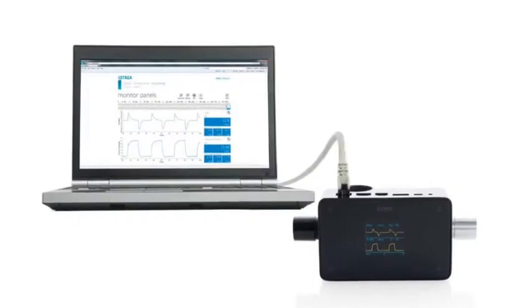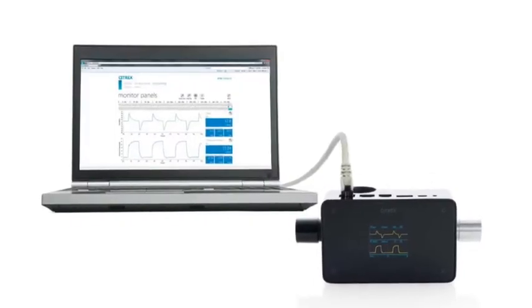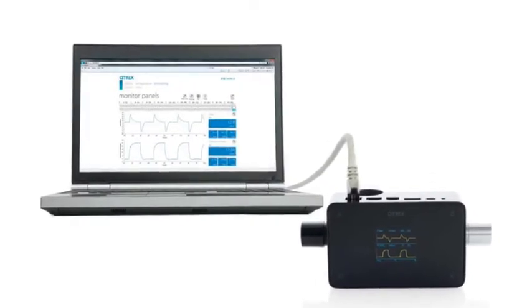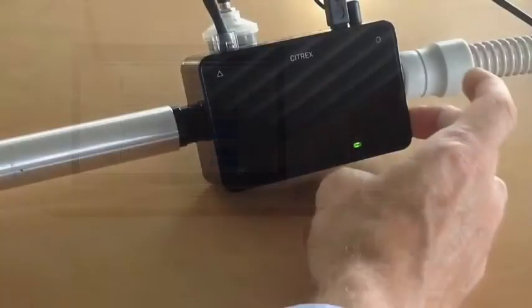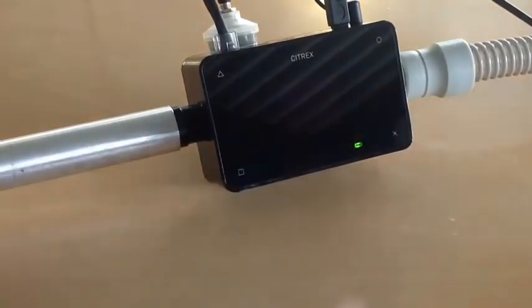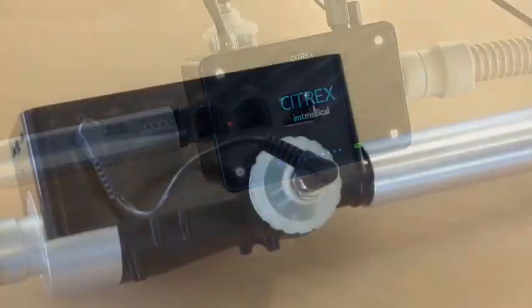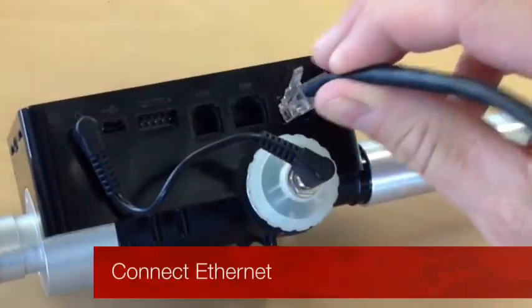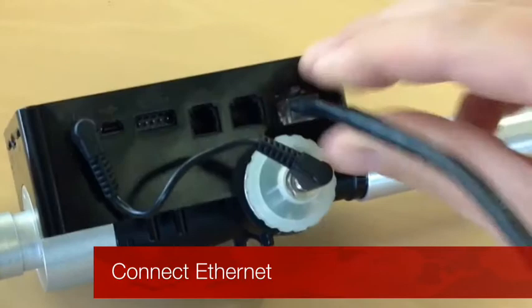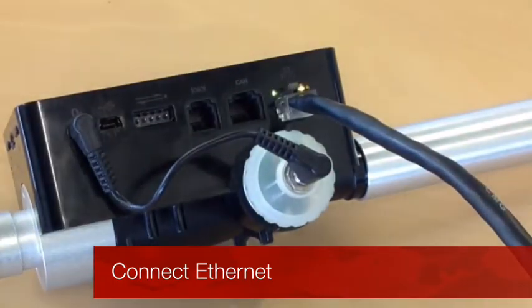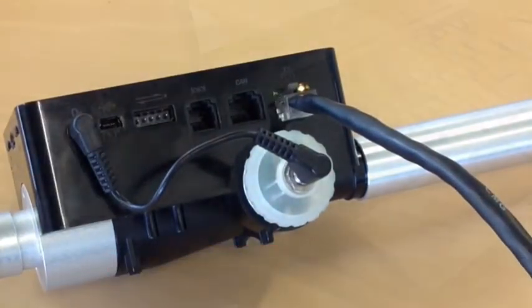Citrex web server is the easiest way to analyze and report measurements just in a browser. The software offers configurations, real-time curves, trending, cursors, and reporting capabilities.